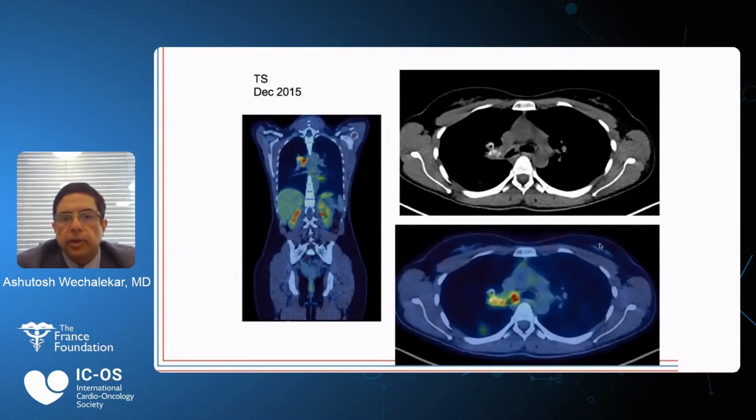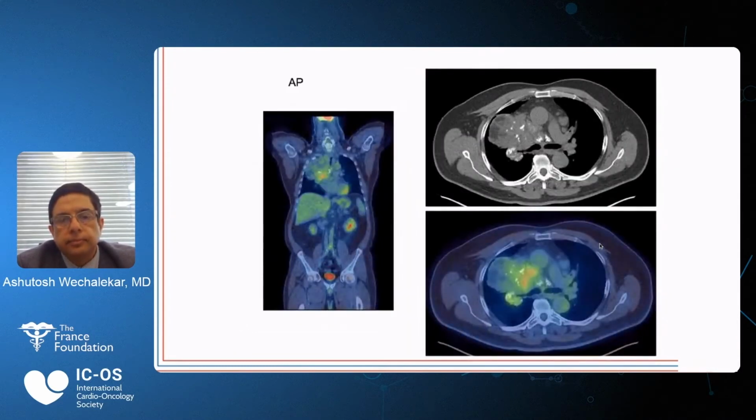And this is another patient with localized amyloidosis showing FDG uptake in the chest in a patient with a thoracic amyloidoma. Next slide, please. This is a different patient with a large lung amyloidoma showing a bit of calcification with low-level FDG uptake, and this patient had Waldenstrom's macroglobulinemia causing this massive amyloid deposit. Next slide, please.